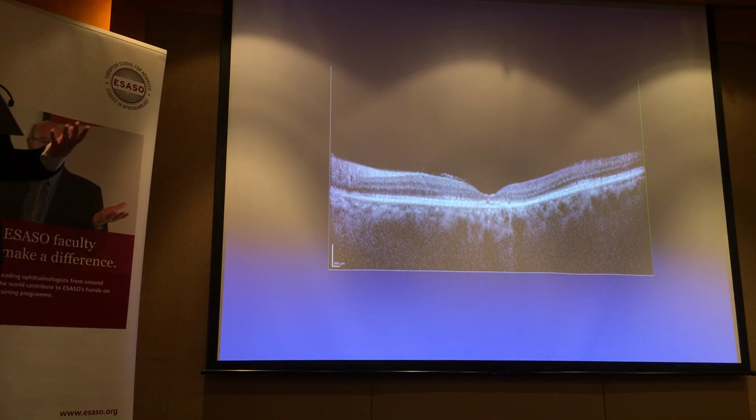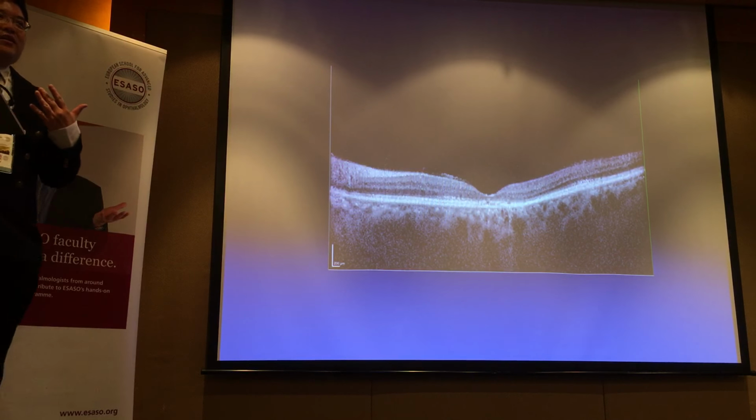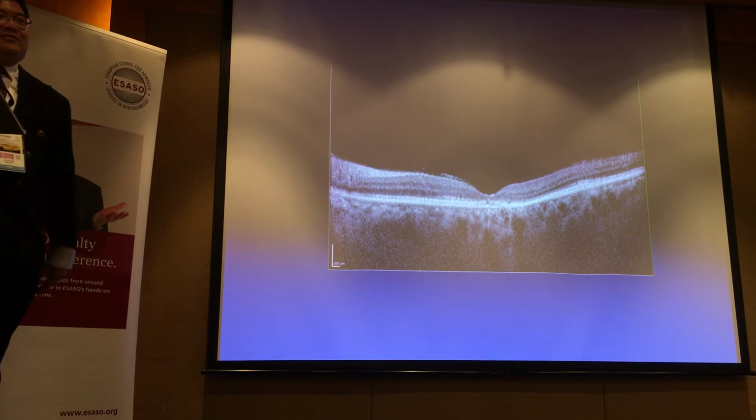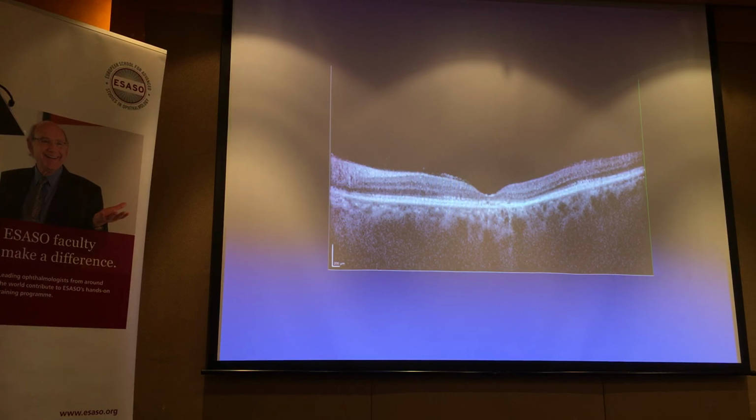That's what people will assume, because you're just thinking of relative, right? If you're tall, then I appear shorter, but if you're this short, then I'm tall. You see? So it's all relative. And again, you need to look at quality, not just quantity. Besides which, there's a range of thickness for retina. This is well within normal, isn't it? So yeah, things like this have happened.